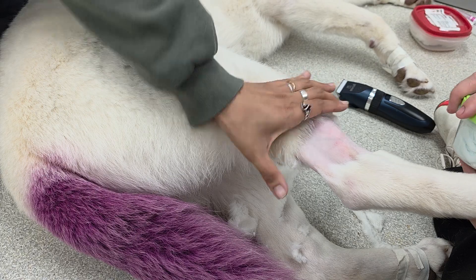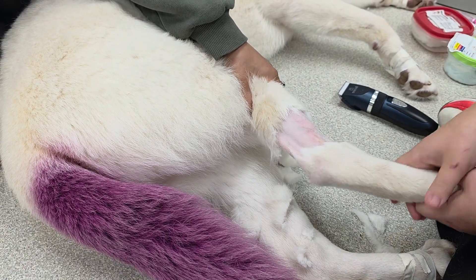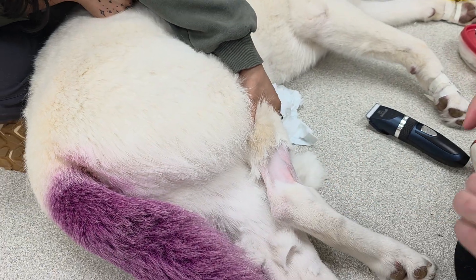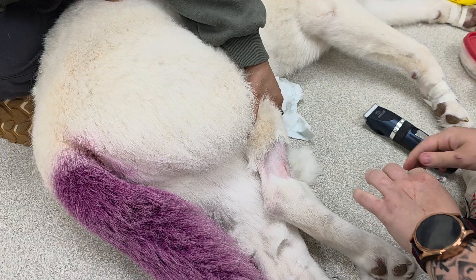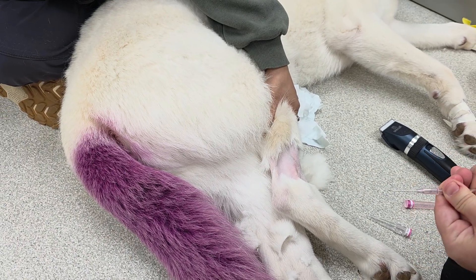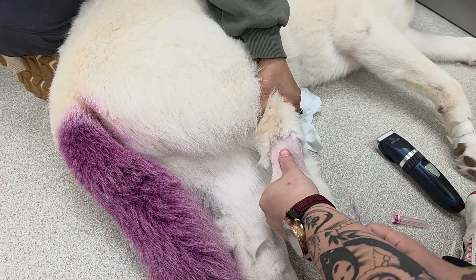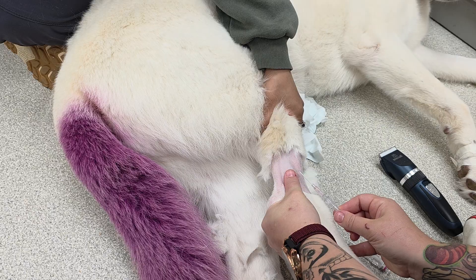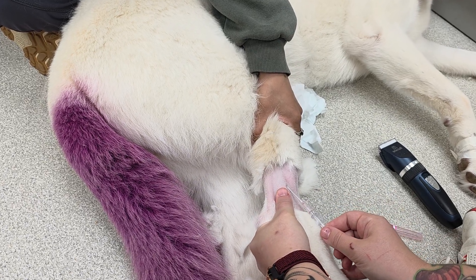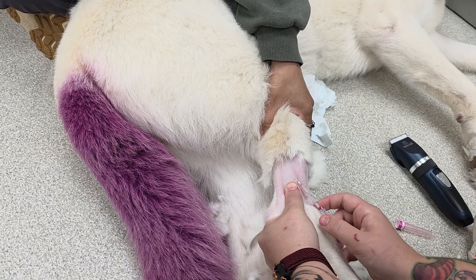Can you hold off? Susan's going to build up my pressure — we can do the same thing we do on the front legs, build up that pressure. We're going to break our seal on our catheter, put your thumb beside it, make sure the bevel is up, and poke. Get blood flow and then feed.